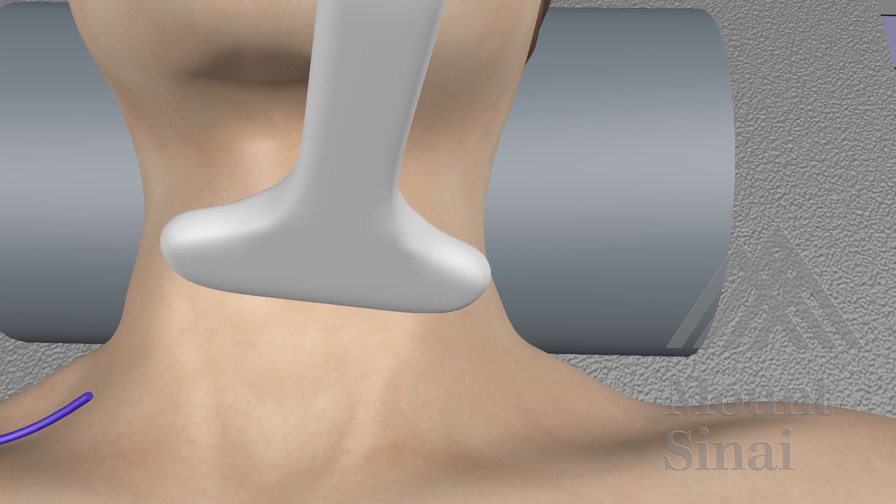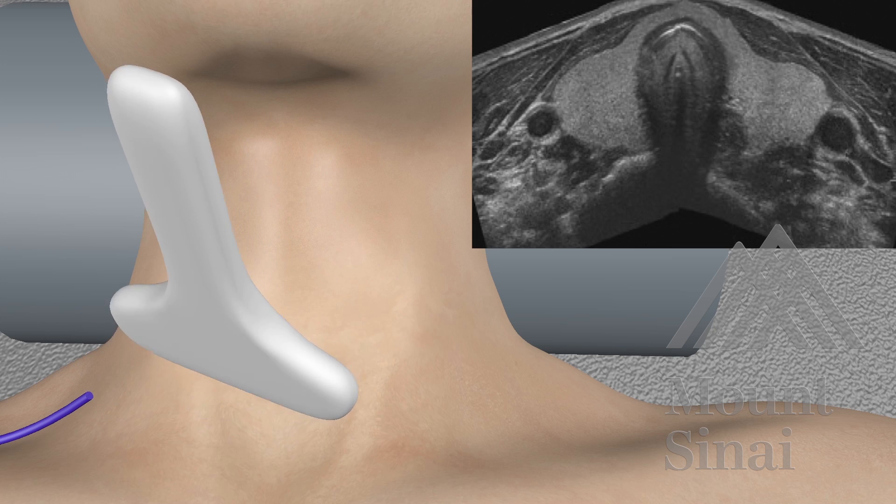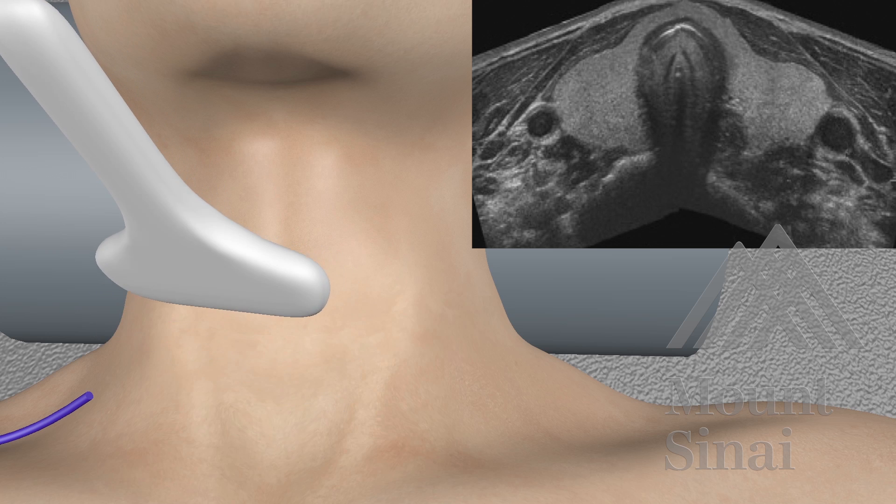In addition to preoperative ultrasounds, we perform an additional ultrasound in the operating room prior to beginning the procedure in order to confirm and assess the pathology of the thyroid.